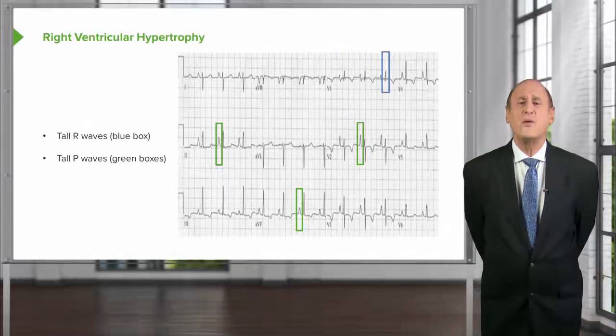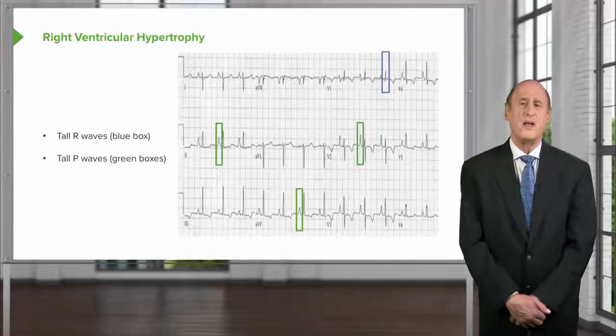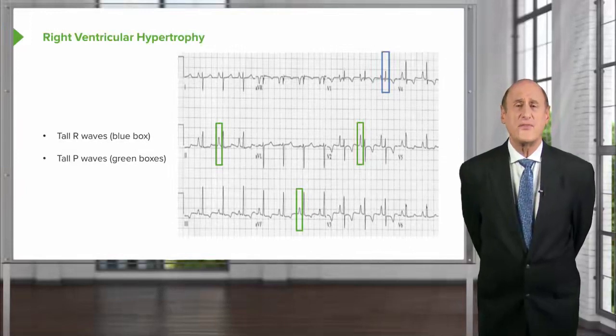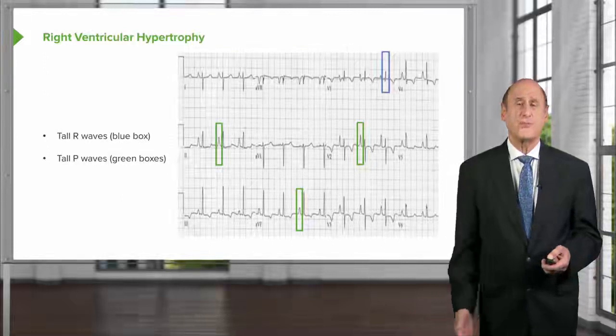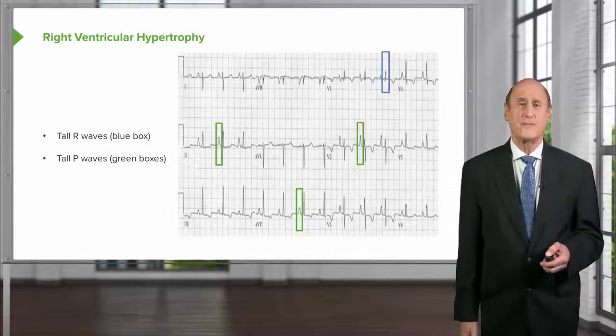And again, these P waves are very suggestive of so-called P pulmonale, or P of lung disease, pulmonary hypertension with right atrial enlargement. You'll also notice the axis here is very abnormal. The maximum R wave is in lead 3. That's plus 120 degrees. So this is a very typical ECG of right ventricular hypertrophy. Right axis deviation, P pulmonale, or right atrial enlargement, and a large R wave in V1. Right ventricular hypertrophy. A patient with pulmonary hypertension from lung disease, a patient with primary pulmonary hypertension, a patient with pulmonic stenosis, all of them could do this.